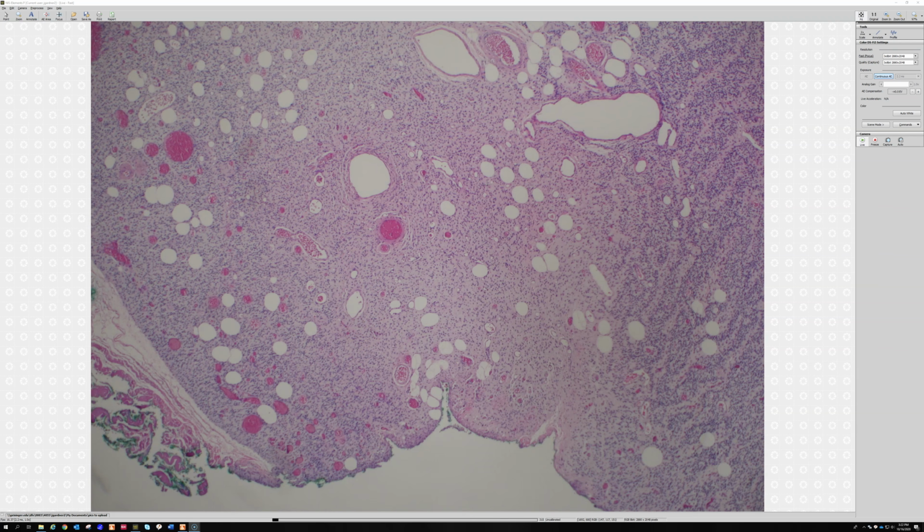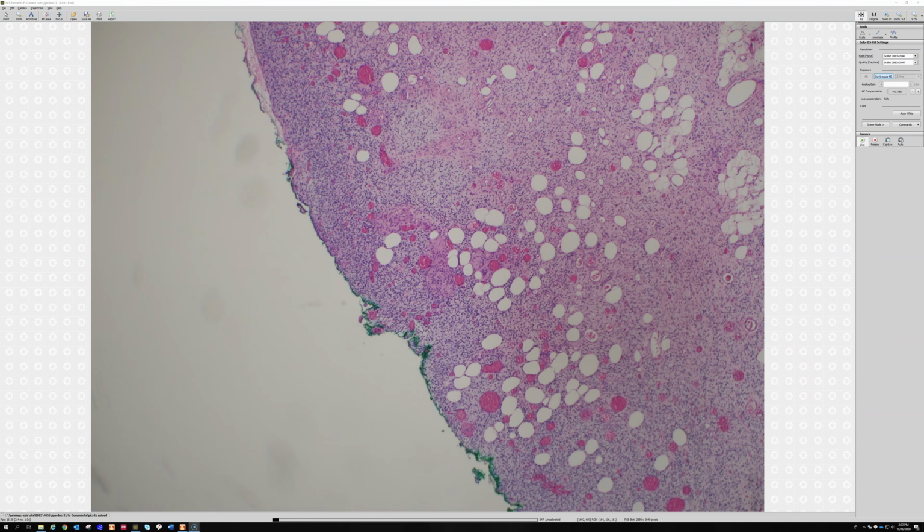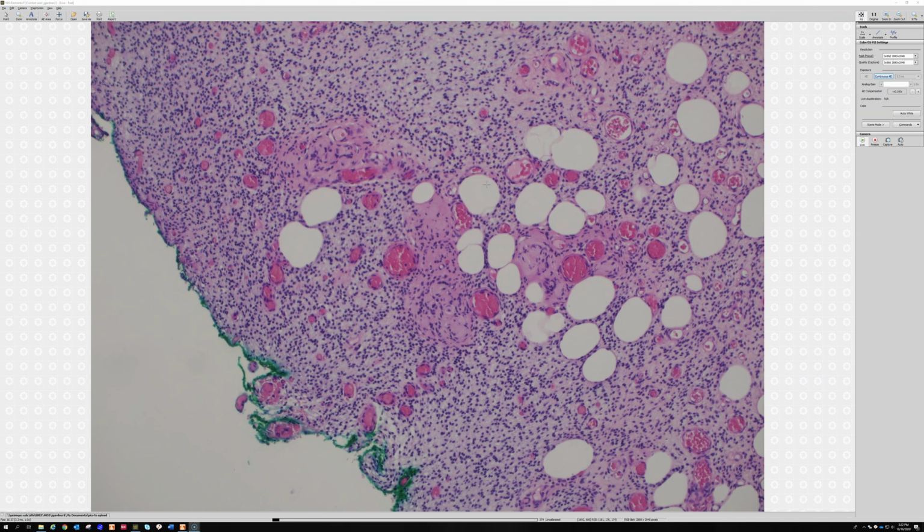particularly fascinating finding. But these Wagner-Meissner bodies, you can see nearly identical structures in neurotized nevi, like congenital pattern nevi that are very thin and spindly, type C melanocytes. You can get structures that look just like this and are Wagner-Meissner-like, or I think the other names for them are Masson bodies or tactoid bodies, because everything has to have several names in dermpath, you know.